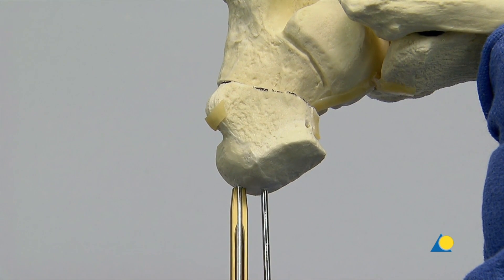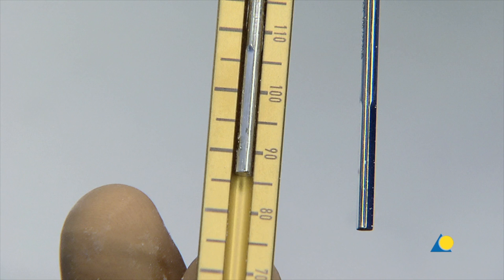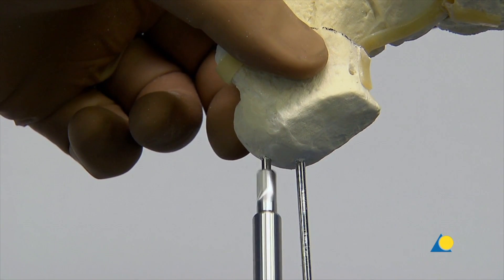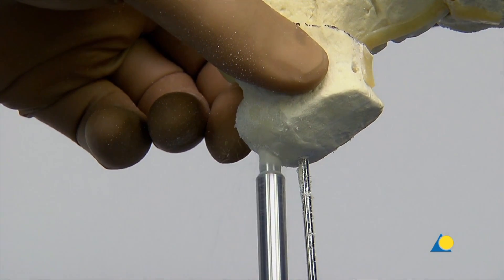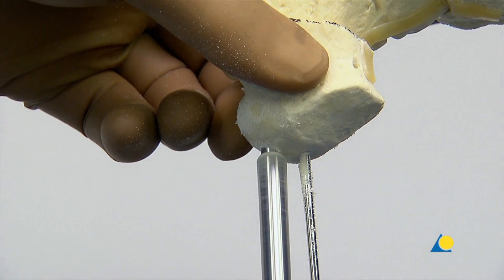The measuring device is slid over the guide wire to determine the appropriate screw length. After measuring, the guide wire can be advanced 5 to 10 mm to ensure that it will remain in position once the drilling is completed. The guide wire is then over-drilled with the 6 mm cannulated drill bit to provide a countersink for the screw head.